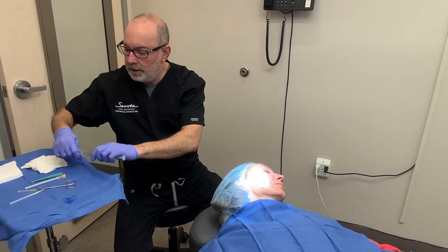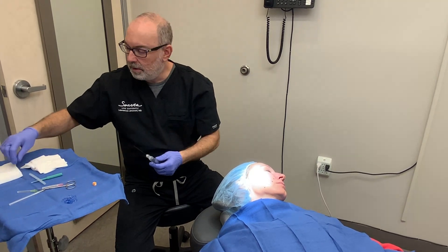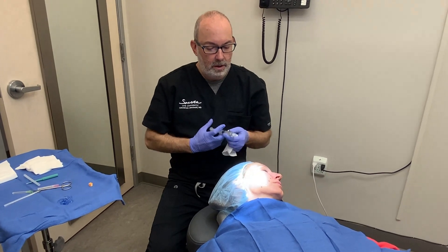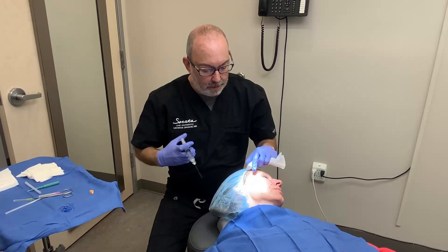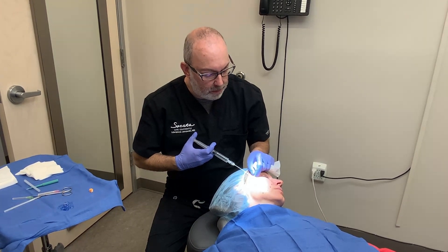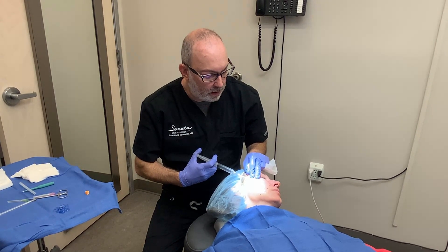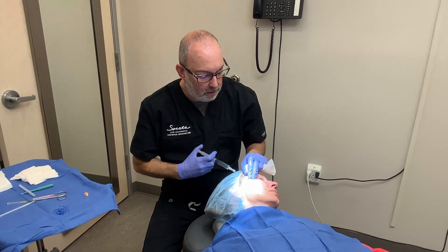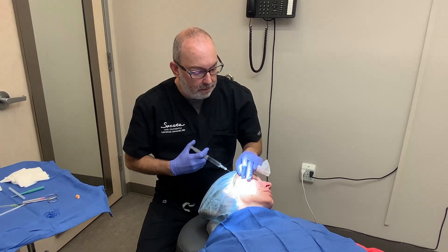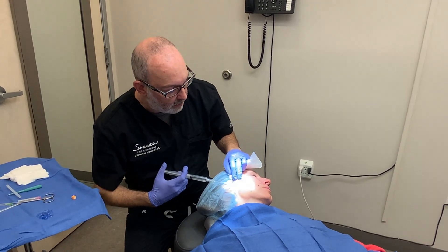Then we're going to numb up, and I'm going to use a 25-gauge spinal needle. It's good because we can reach all the areas with one poke, essentially, or one poke from each entry point. It's a little bit stingy for a second, but we'll get it in quick — we don't need a lot. We can typically get away with five cc's per side.